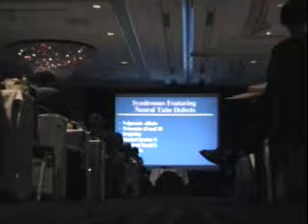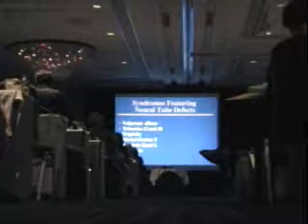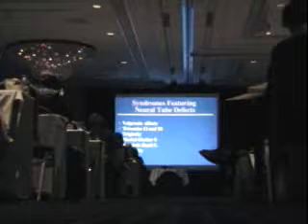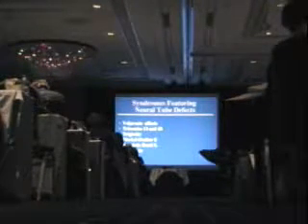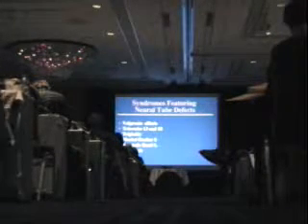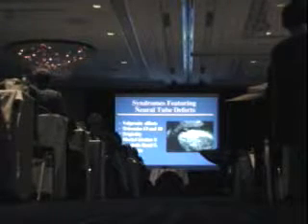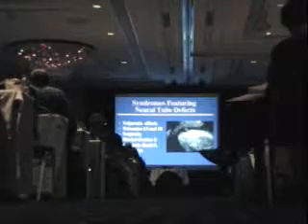Then there are some syndromes such as Meckel-Gruber syndrome, which is an autosomal recessive syndrome that involves encephalocele, which is a form of neural tube defect up high, polydactyly, and cystic kidneys. That's another lethal abnormality. Amniotic bands can disrupt the spine, can disrupt pretty much any part of the neural tube. And if you look at the spine, you will see these neural tube defects a lot of times as sacs that emanate from the back.